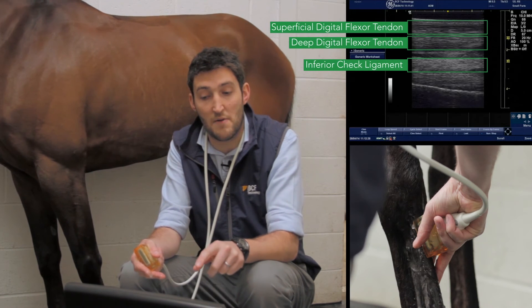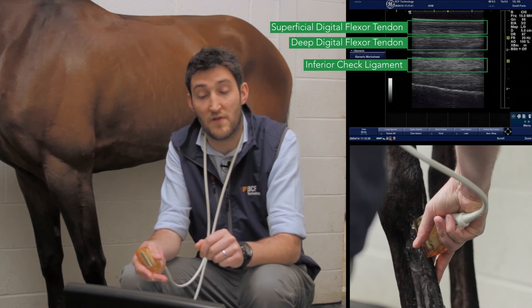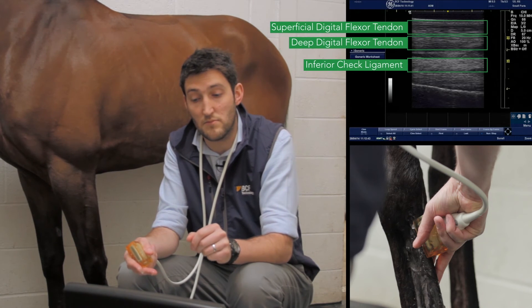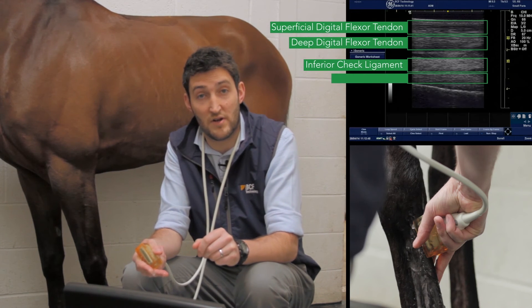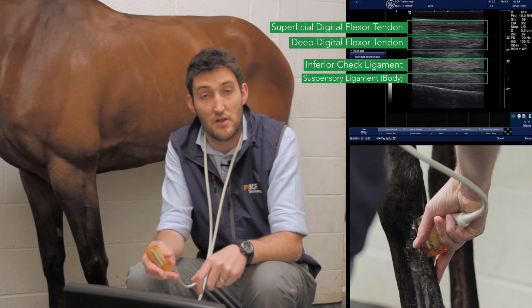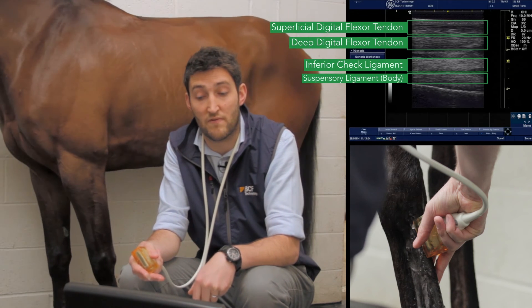You can see that the fibre pattern on that structure is denser — appears denser — and the fibres appear shorter, and that's because of the oblique nature of that structure as it runs from proximo-dorsally to disto-palmarally. Below that we then have the origin of the suspensory ligament — that's the body of the suspensory ligament at this particular place — and then our thin white line underneath that is the proximal part of the third metacarpal or cannon bone, just the palmar border of that. On this image you can also see where the suspensory ligament is starting to insert onto that structure.